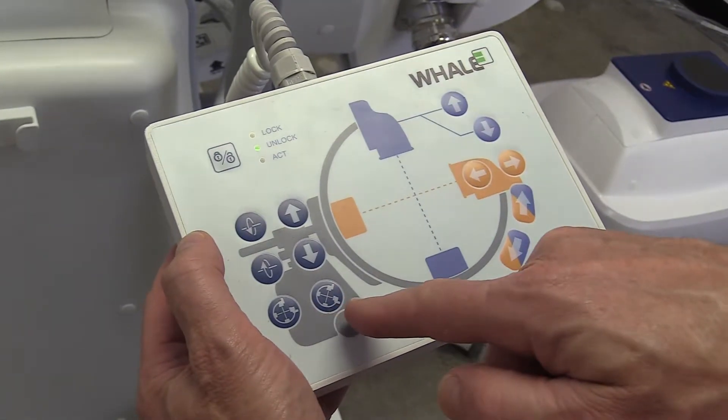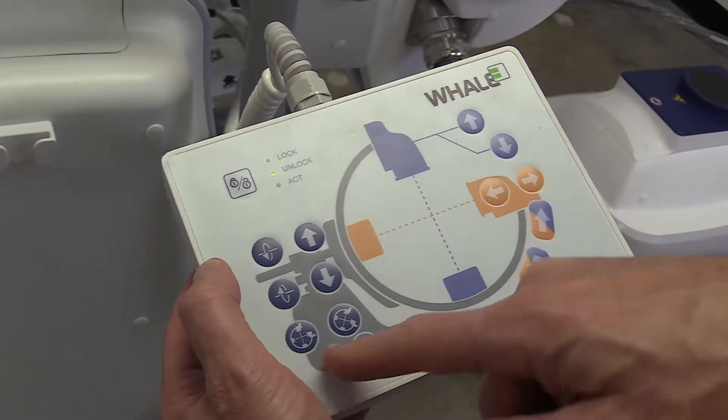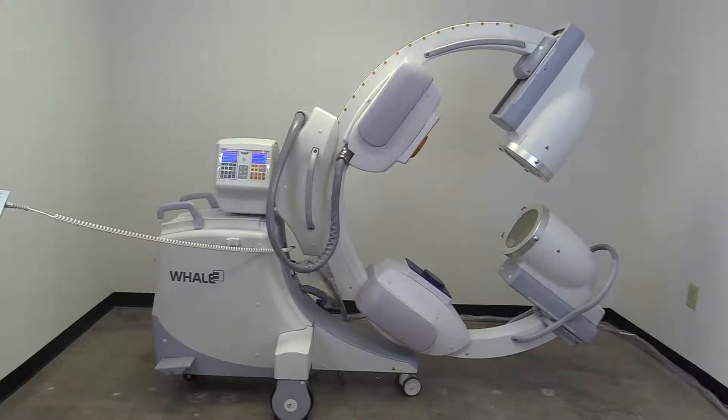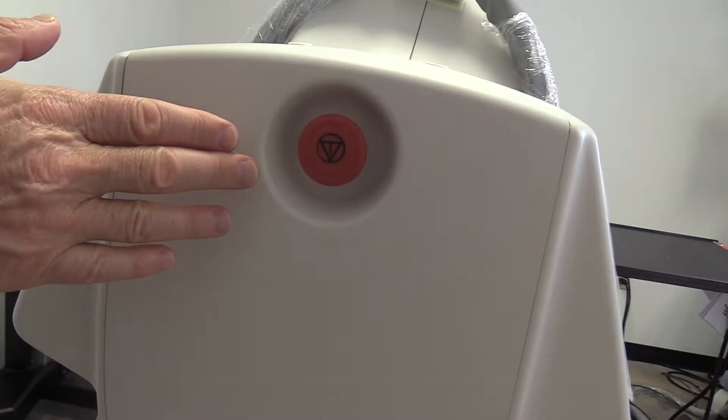Finally, there are two buttons for resetting the position of the machine to either a neutral or compact position for storing and traveling. Similar to the console, the scanning unit also has a red emergency off button.